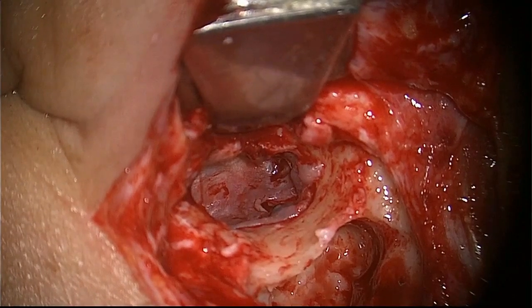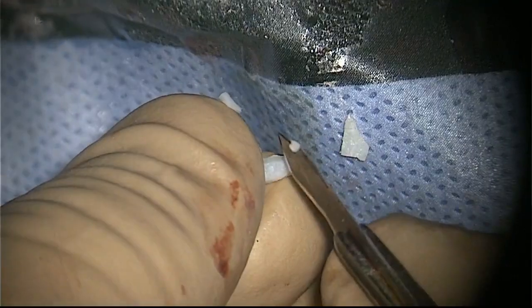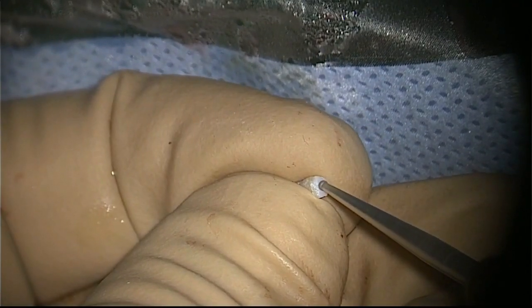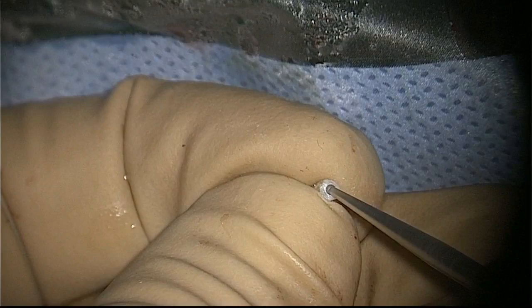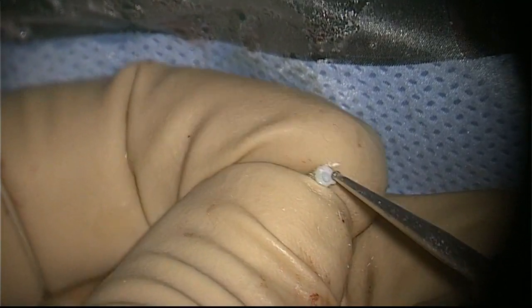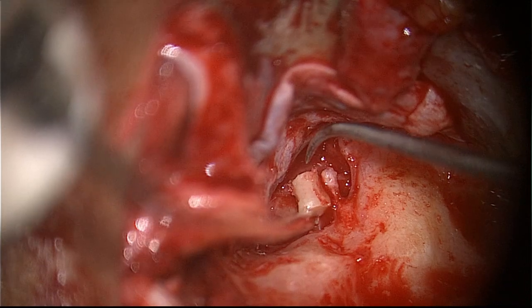To conclude, ladies and gentlemen, the search is there for what is an ideal prosthesis. The ideal prosthesis should be the one which is easy to sculpture, cheap, and with low extrusion rate, and the results have to be reproduced by the average surgeon.